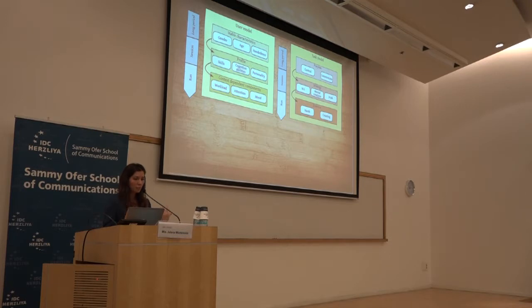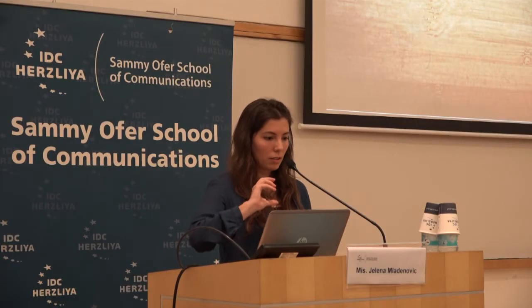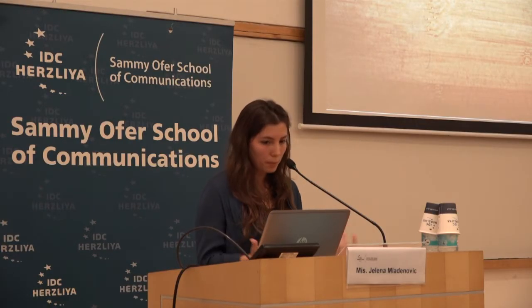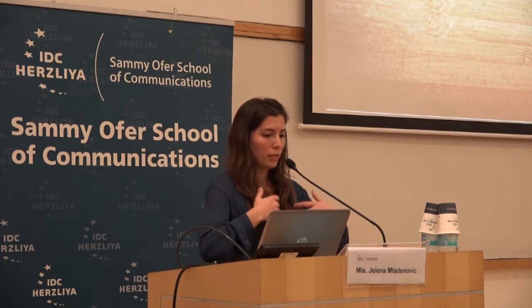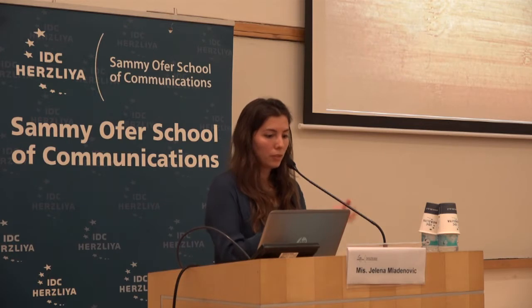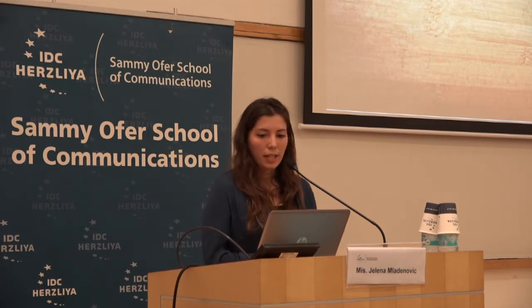But if the person is not able to create motor imagery for controlling a wheelchair, for example, then the BCI should provide the possibility to switch from one paradigm to another to enable the user to use this system. Even though one paradigm doesn't work, the other one would.